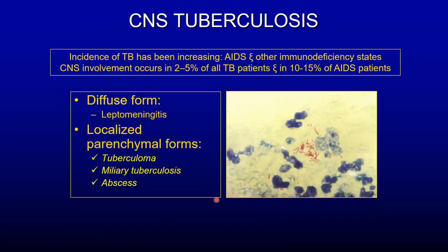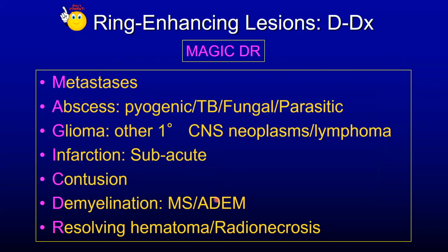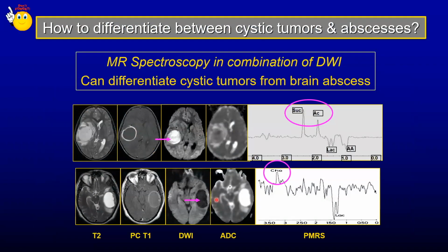Sure. So I don't know if you're going to talk about that, but one of the problems I have encountered in determining if the FLAIR scan is abnormal is in cases of young people, where they frequently have very little subarachnoid space over the hemispheres. And so it can be difficult to tell if the sulcus is absent because the brain doesn't allow much filling of CSF around the hemisphere, or because it's filled with some debris or protein, which is why it's not suppressing on FLAIR.